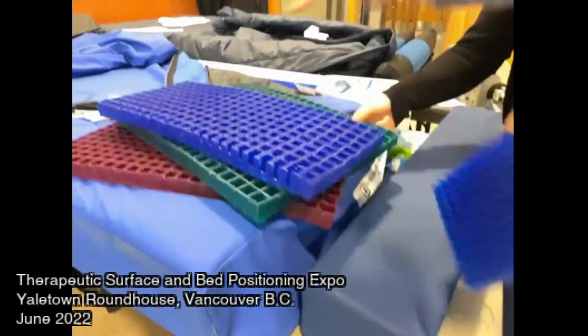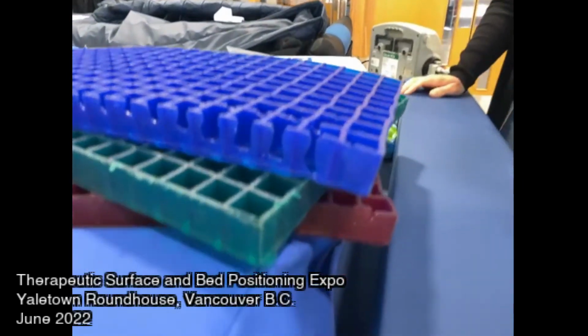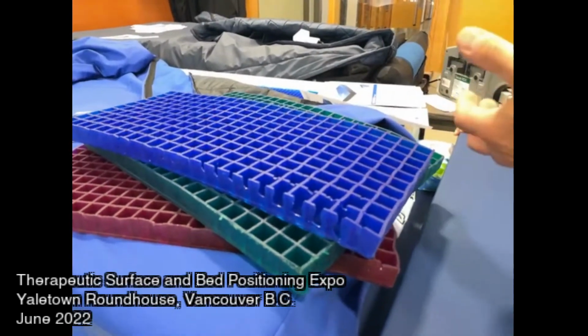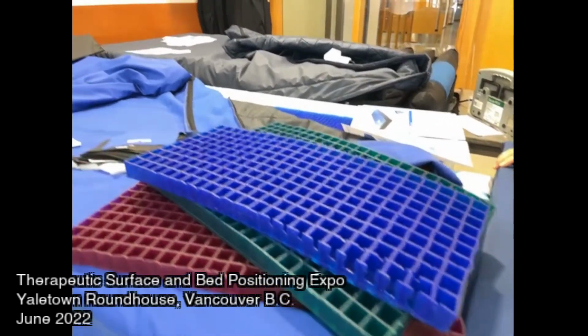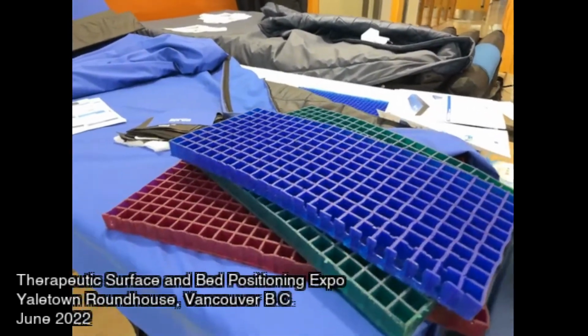We'll layer these up for different weight capacities of the cushion. Oh, okay. So these would be higher risk people who don't need as much positioning or contouring within a wheelchair cushion. And then the stuff in mattresses, just because we have that 1.5 inches, we get more immersion into it. That's kind of how things work.